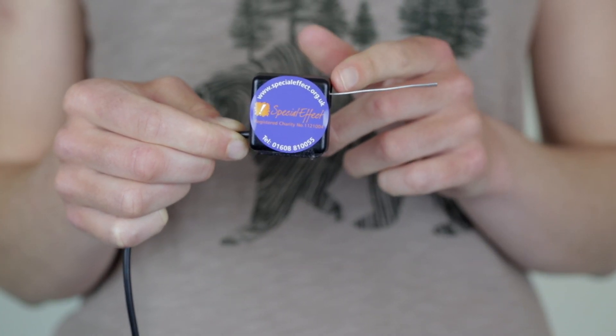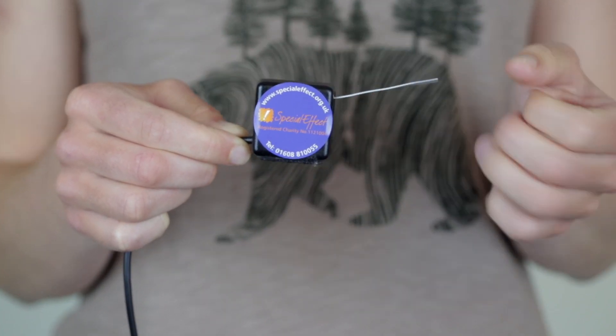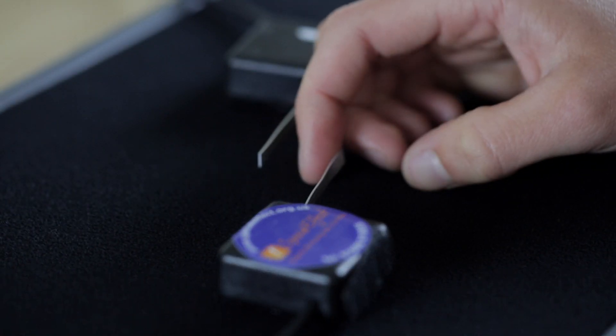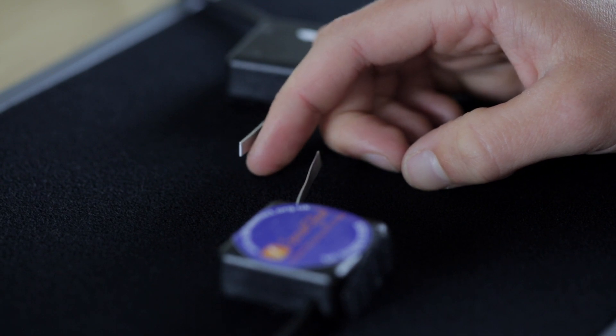This switch is a very lightweight lever style switch and only takes two grams of pressure to activate. We use these with people who have very limited strength or very small movements.